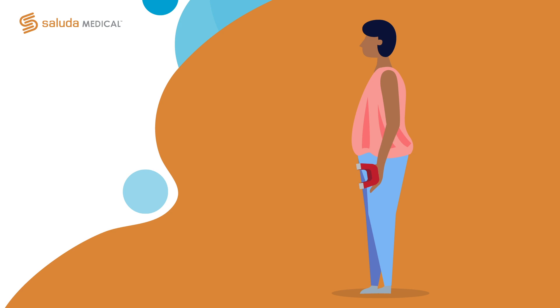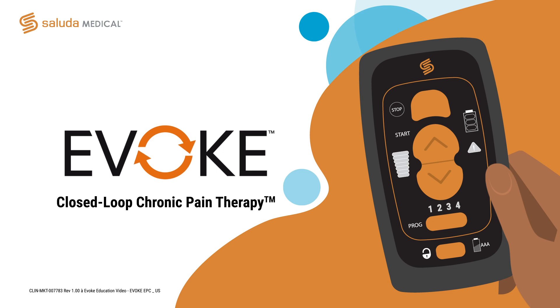Do not hold the magnet over your device for more than 10 seconds — this will cause your device to shut down and you won't be able to control it with your remote. If you happen to turn off your device with the magnet, you can restart it by beginning the charging process. Once you start charging your device, you will be able to control your stimulation with the remote.